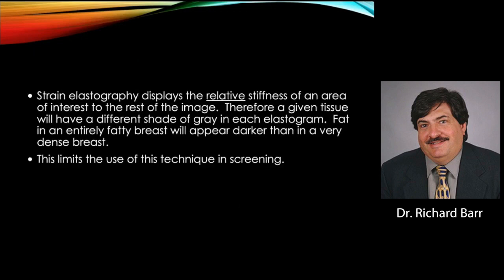It's quite simple. But again, you have to remember that we're looking at the relative stiffness. So just because something is the stiffest in that image, it doesn't mean it's a cancer. And you can use different colors. I like to use black and white, where black is stiff and white is soft. I find that I can do measurements better, and I can see artifacts a lot better.